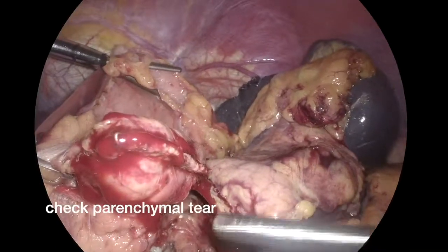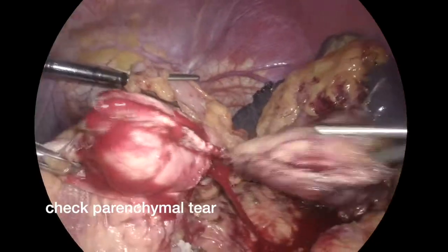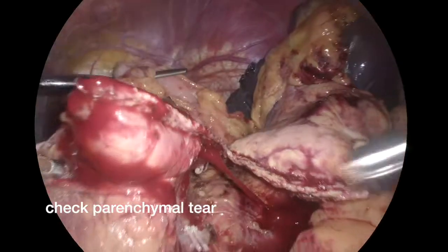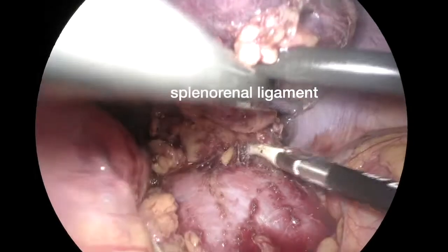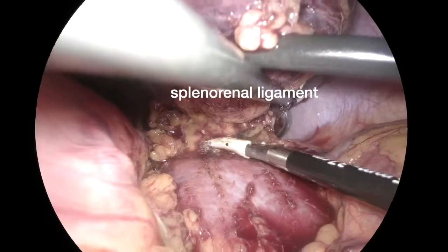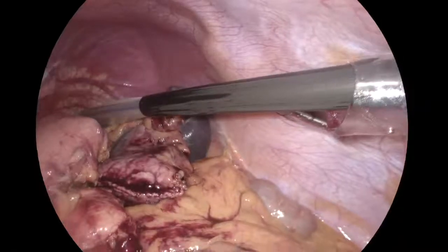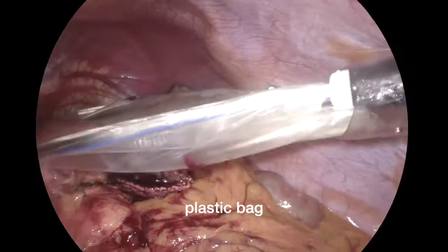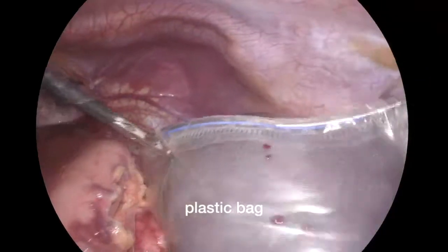The pancreatic stump was checked for whether there was parenchymal break or bleeding spot. The last remaining splenorenal ligament was resected. The specimen was put into a plastic bag and was removed via the Pfannenstiel incision.